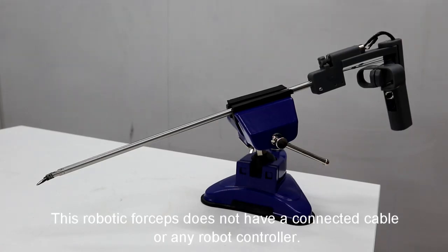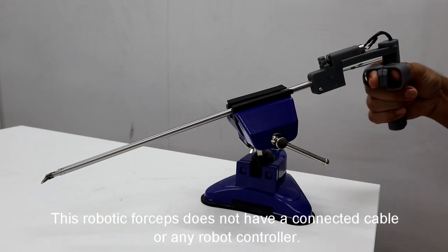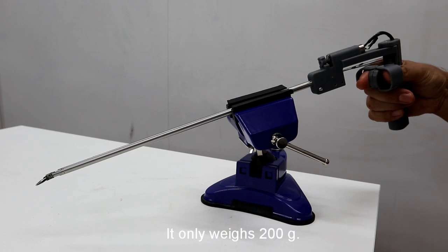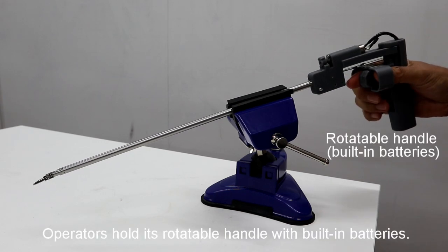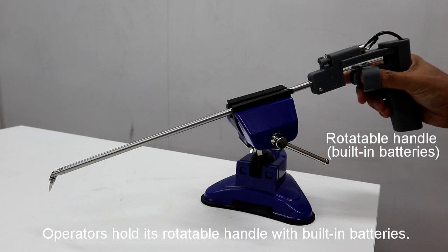This robotic forceps does not have a connected cable or any robot controller. It only weighs 200g. Operators hold its rotatable handle with built-in batteries.